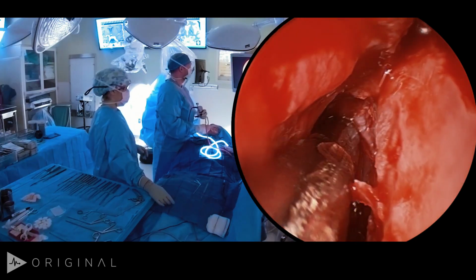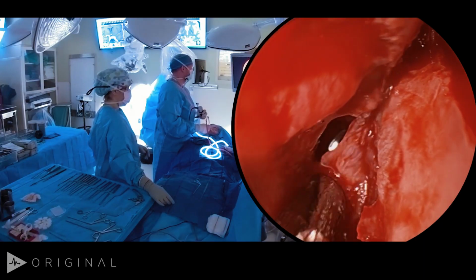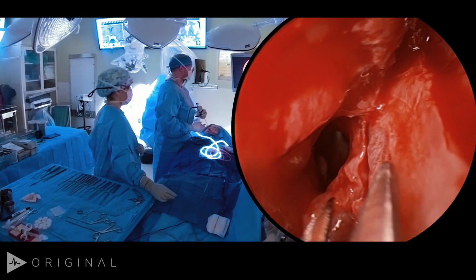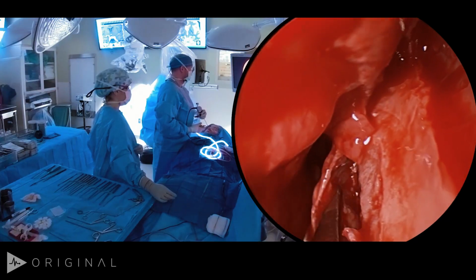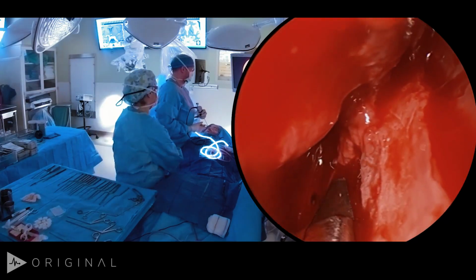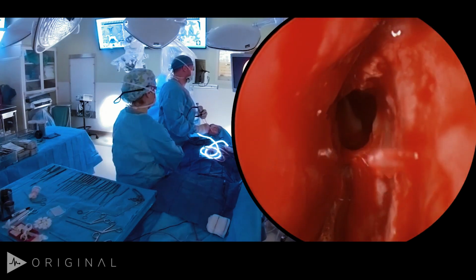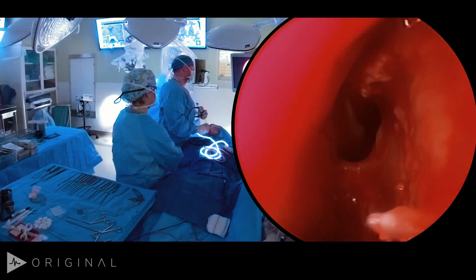One of the pitfalls here is if you don't release this mucosa from its attachment within the sphenoid, you can get hung up here, which is where we're hung up at the moment. Bellucci scissors. You just want this small nasal septal flap to drop down so you can roll it into your nasopharynx. Alright. So again, just kind of bringing this down off the face of the sphenoid here. Eventually we'll see the sphenoid rostrum.